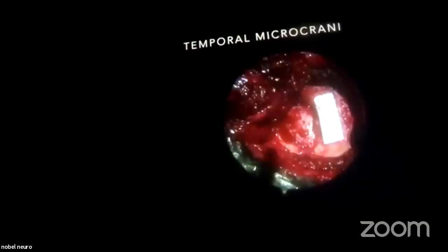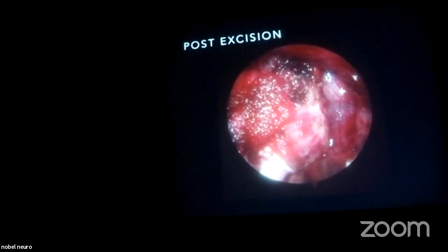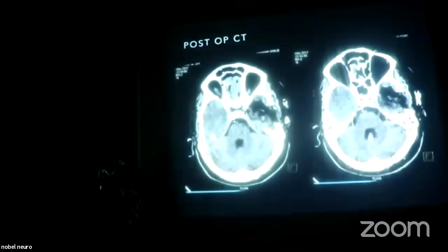Temporal lesion. Again, small craniotomy. This is the tumor. And now you can see this white cord. This is the optic nerve, and the tumor is removed. Patient discharged in 3 days. Very rare histology.